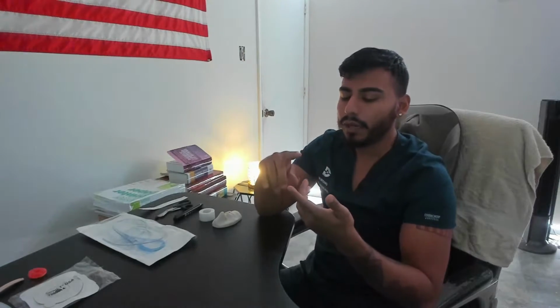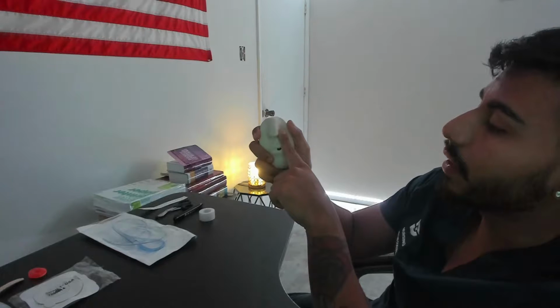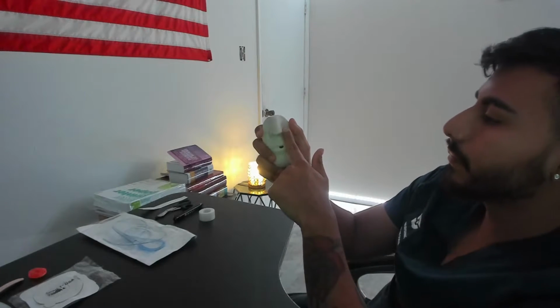And what I'm going to do is look for which nare I want to go to. I want to avoid a nare that has undergone surgery or has any injury to it. I want to go with the nare with the greatest airflow. I'm going to check for patency, and the way you check for patency is I put one finger on one nare at a time. Tell the patient, take a breath in. Again.